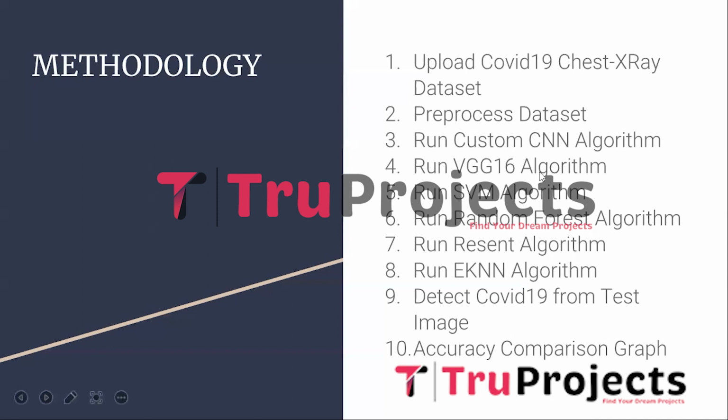The fourth module is Run VGG16 algorithm. This module focuses on training a VGG16 CNN model. The VGG16 architecture is a pre-trained CNN model known for its effectiveness in image classification tasks. The module involves training the VGG16 model using the pre-processed dataset. Additionally, it calculates the various evaluation metrics such as precision, recall, F1 score, and accuracy, along with a confusion matrix to assess the performance of the model.